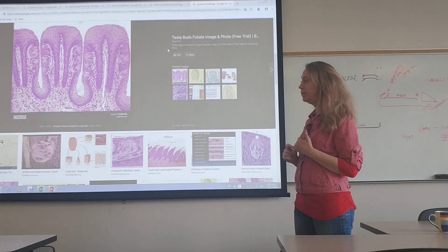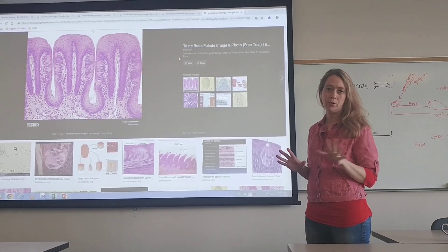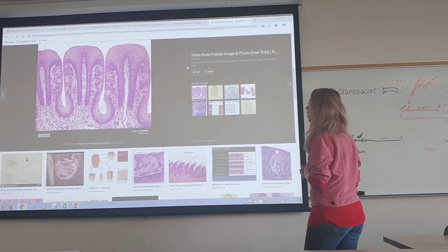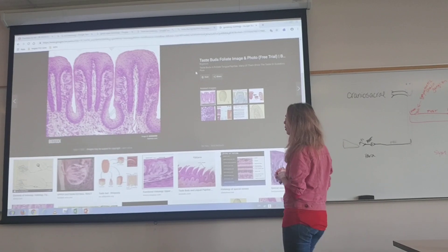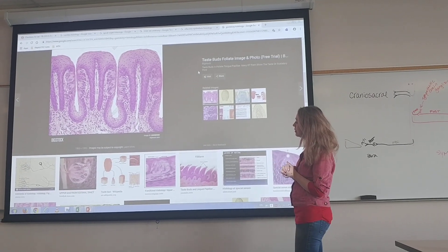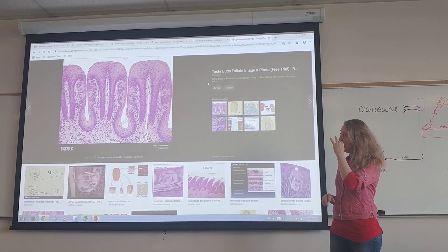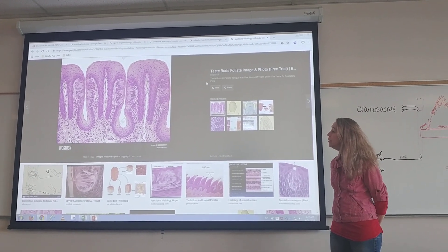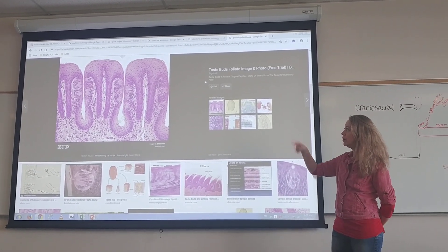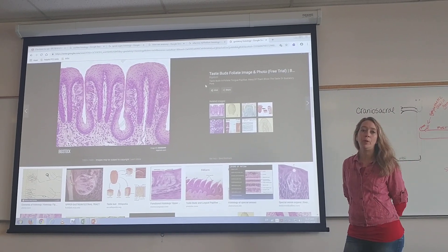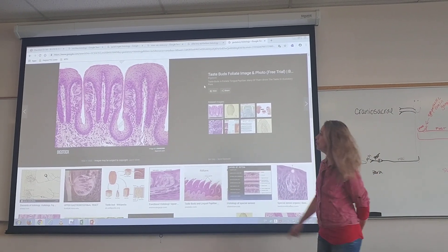We're looking at histology for special senses. We're going to start with gustation, taste. What we're looking at here, you can see the whole papilla — that whole mountain or hill shape.